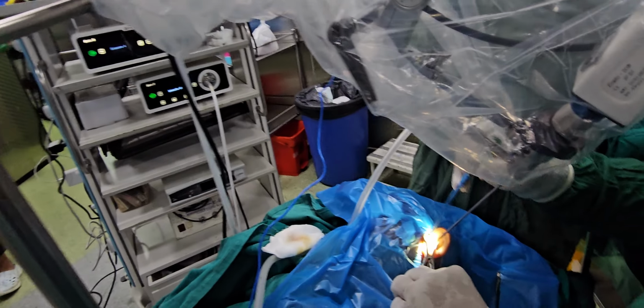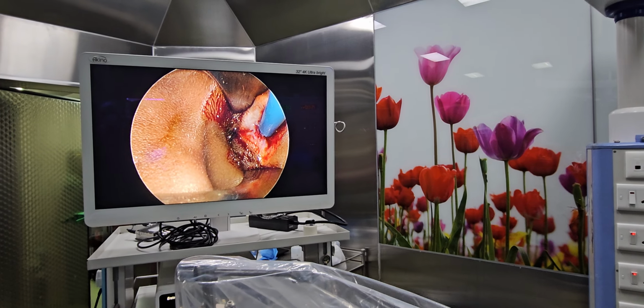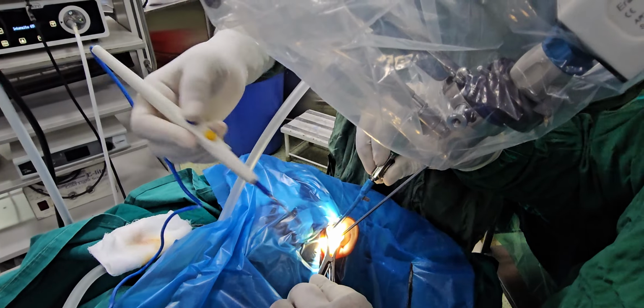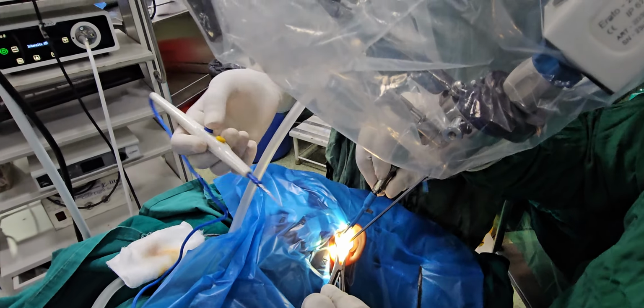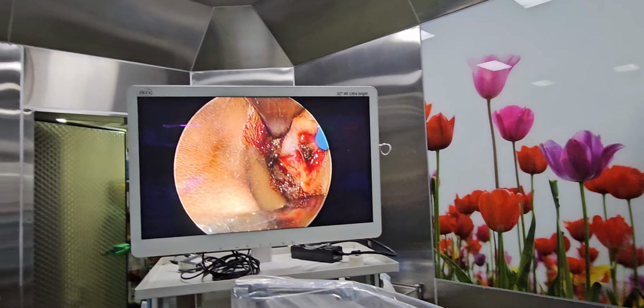This area is very important. Suction, please. Okay, so this is the insulated suction.